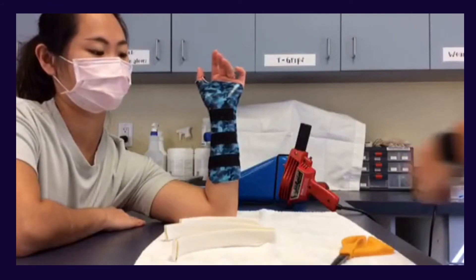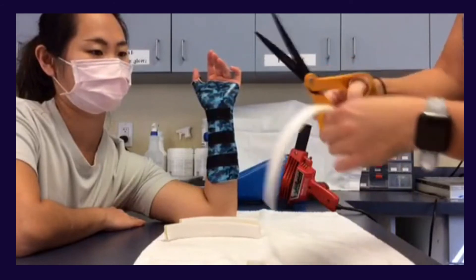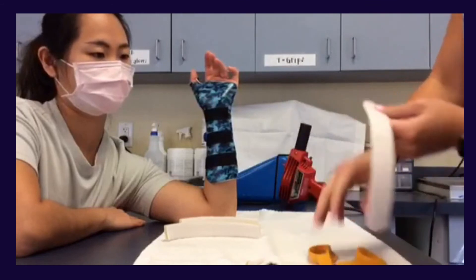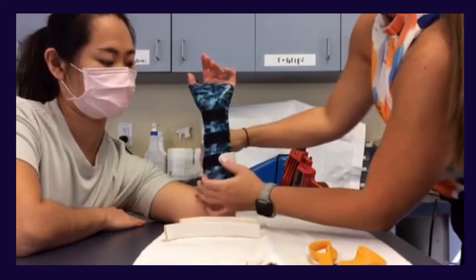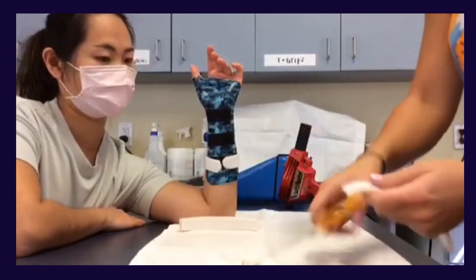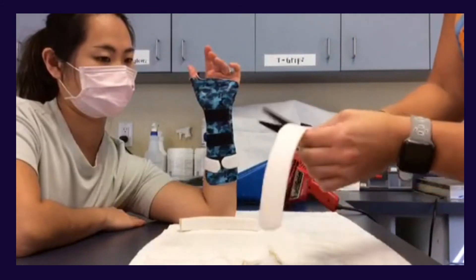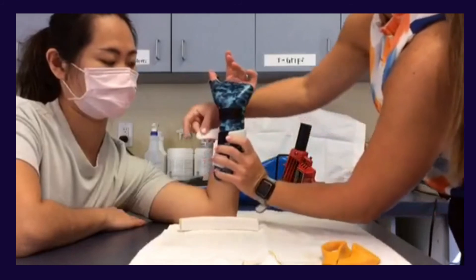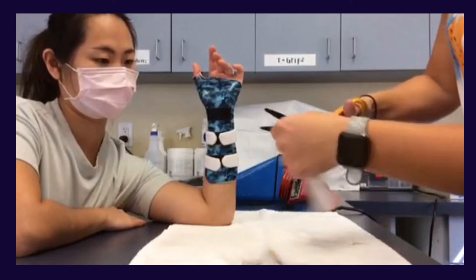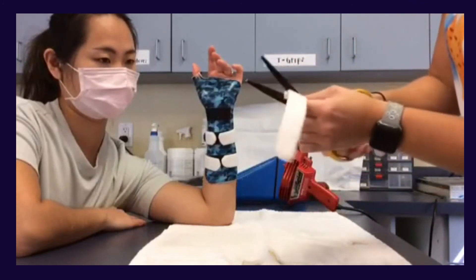Once your hook velcro is applied to the orthosis, don the orthosis onto the patient and start applying the soft strapping, ensuring it fits the patient correctly and securely. I like to round the edges of the soft velcro for comfort. Once you are done strapping, have the patient practice donning and doffing the orthosis to make sure they know how to do it correctly.